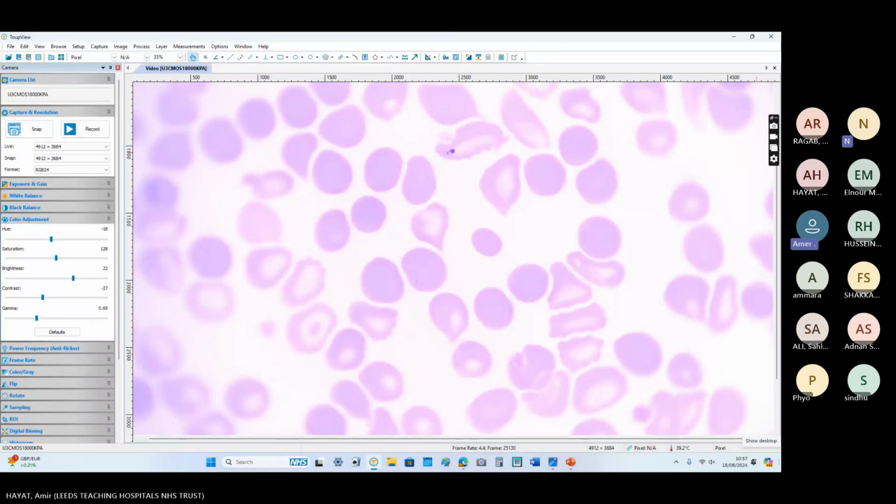You would say this blood film contains microcytosis, hypochromia, multiple target cells, Howell-Jolly bodies, plus transfused red cells as well, or you can say dimorphic picture in the beginning. The white cell count and platelet counts are normal.